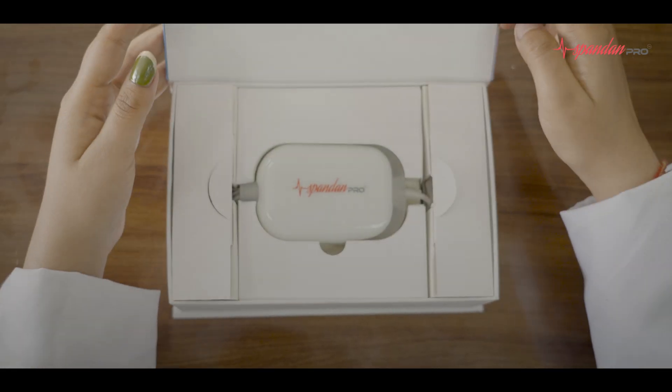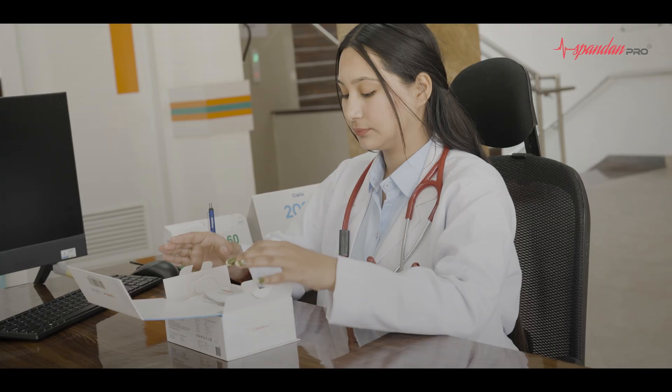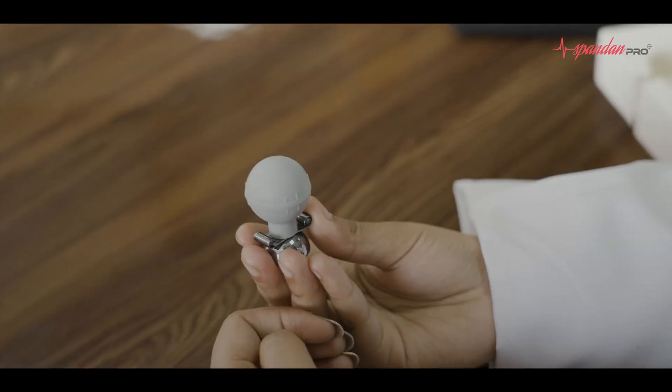Spandhan Pro 12 Lead ECG Machine, specially designed for healthcare professionals. Let's learn how to use it. It comes with a detailed product guide, connecting cable, suction bulbs, and chest leads.